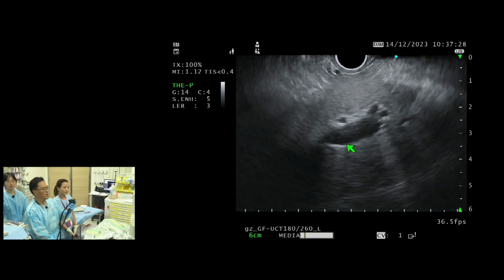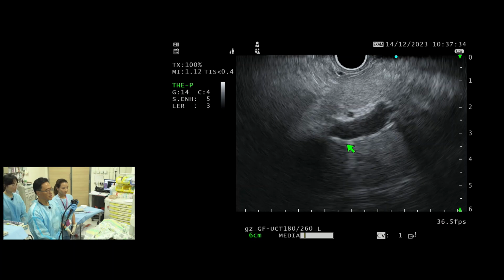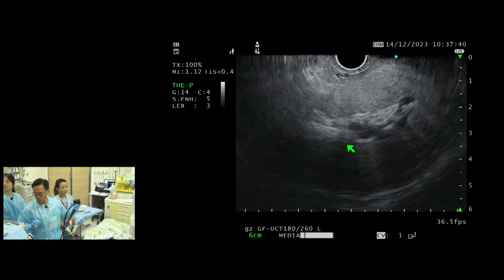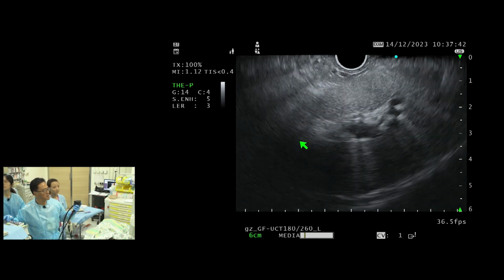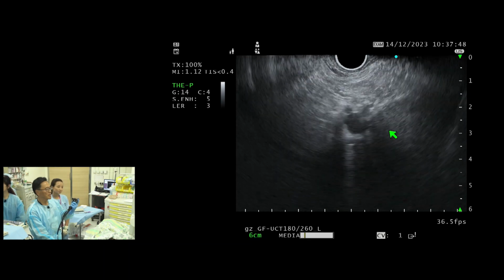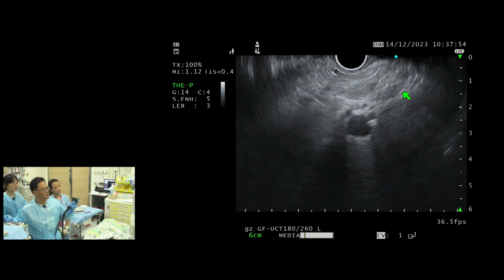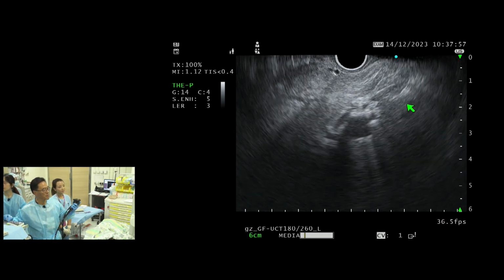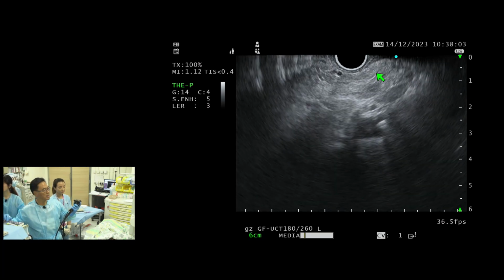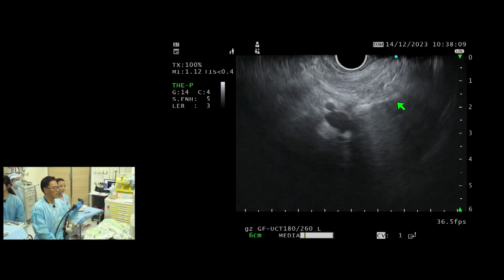The left portal vein is identified by the thicker, more hyperechoic wall, and it's tethered on the left by the ligamentum teres, and on the right is the ligamentum venosum. So this is the ligamentum teres here, and then ligamentum venosum will be on this side right here. So we have ligamentum venosum, ligamentum teres identifying the left portal vein, and that would make this segment 1 and this segment 4.